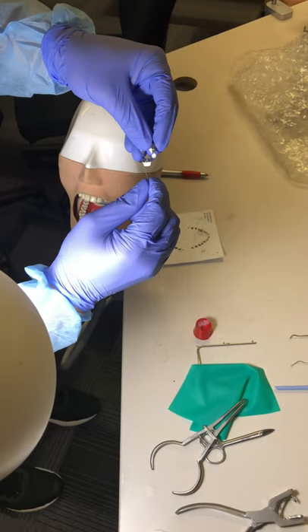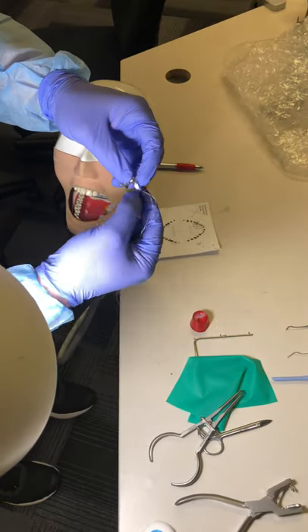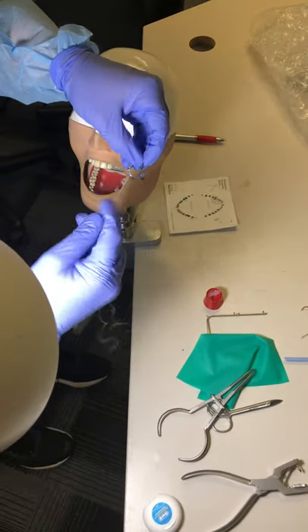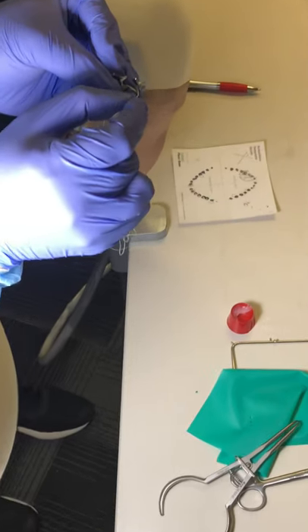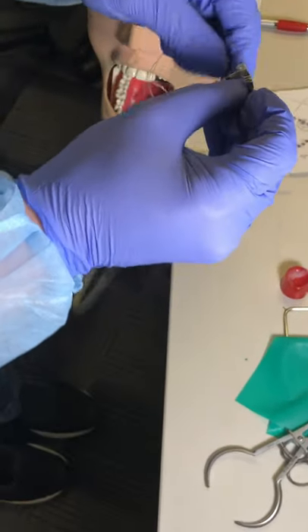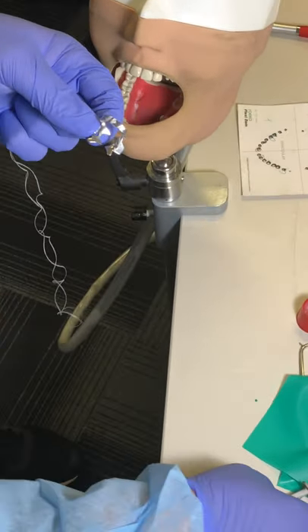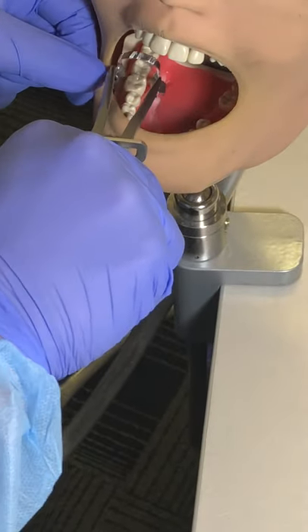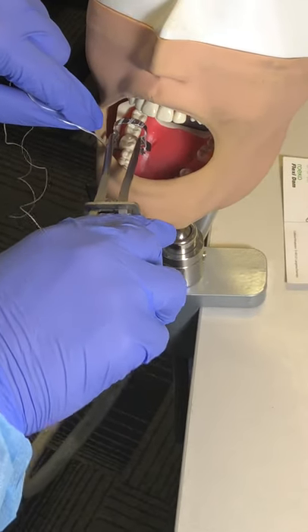This is the first tie. Then we need to wrap it around the bow multiple times — not too many, but at least five or six times. Then take the two ends back out through the buckle hole. This ensures we have a secure clamp, so if it fractures from the bow, the ends are secured and won't go into the patient's throat. Check the clamp again, pull it to confirm stability, then remove it.